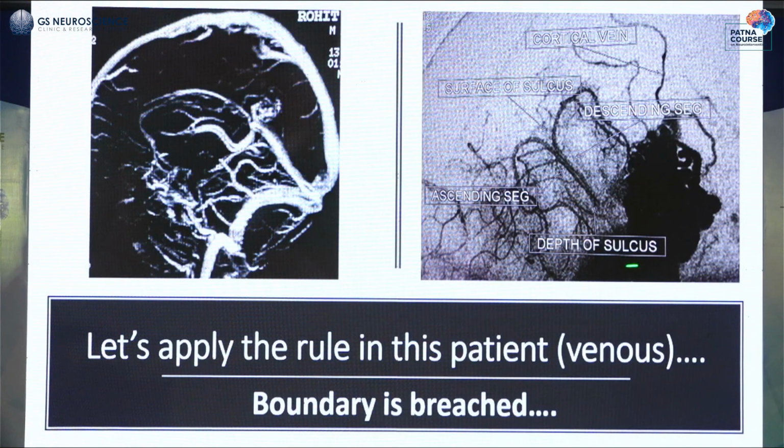This was while we were doing the case, not a microcatheterization prior to the case, but I thought this understanding is important. These are the vessels which run on the surface of the brain, and they dive, come up, and that is how they travel.